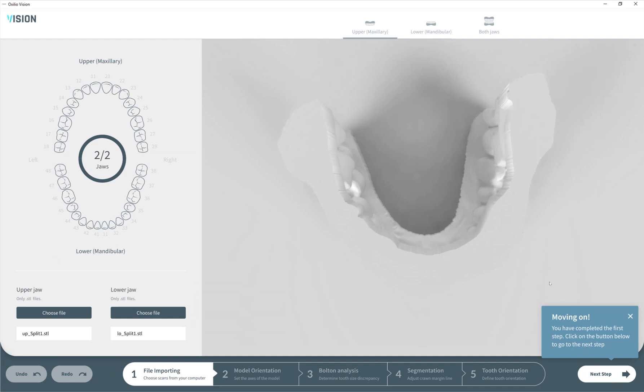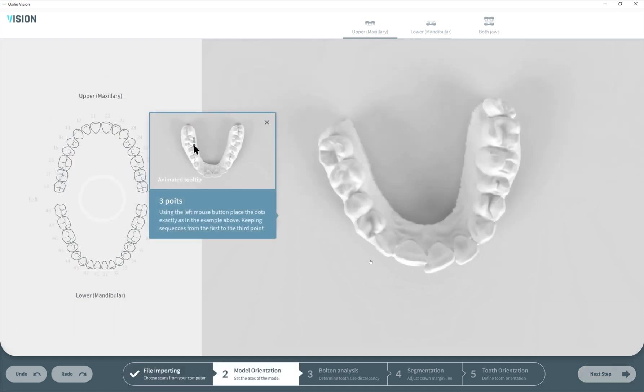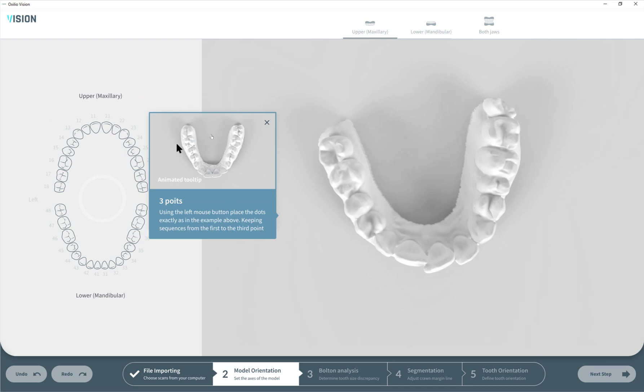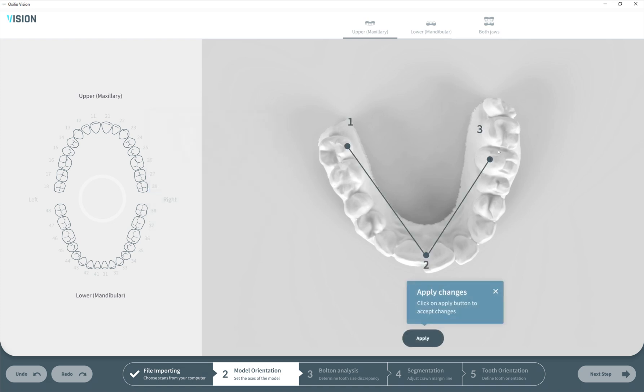Now we can move to the next step. Here we can see the animated guides. Later in this tutorial they will not be animated, but in the final product they will be. Here we need to put three points which will lay in our XY plane and put our model in the correct position.